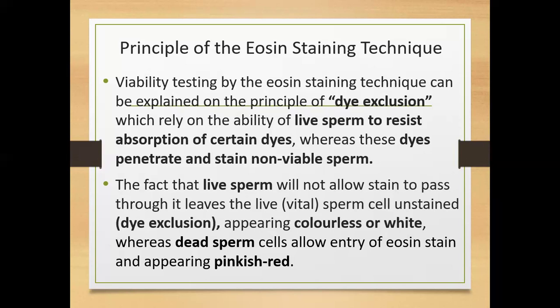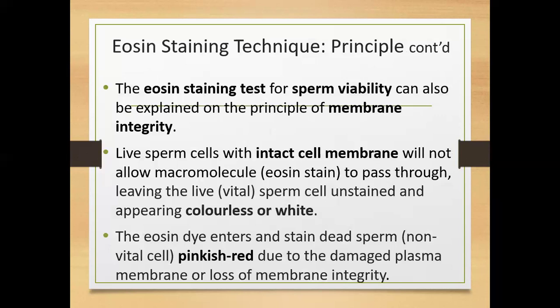All right. Then there's another principle, in the same line, called the membrane integrity test. One is talking about dye exclusion, the fact that once the cell membrane is intact, it will prevent the dye from entering, just taking the dye away.